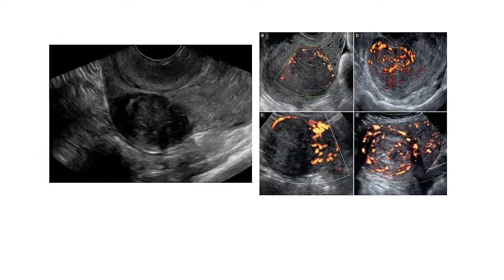So this is another fibroid there. You can see that there's peripheral vascularity that you're seeing there. So that's this one. So at times when you see blood flow inside a fibroid, it will mean that that fibroid is transformed into cancer. So at times fibroids can transform and become cancerous. So you must be on the lookout for that.